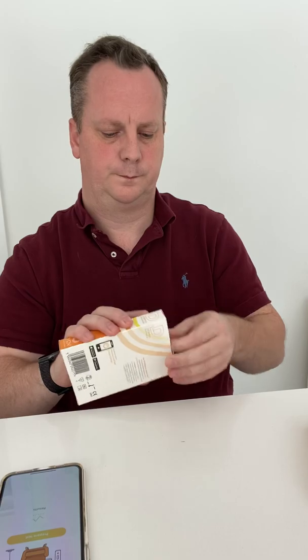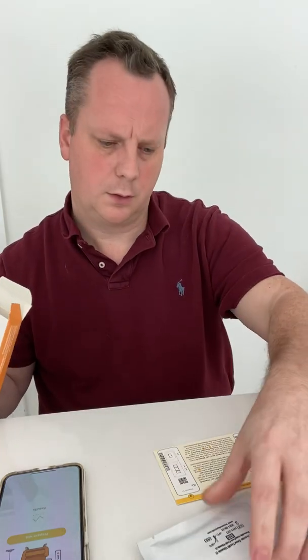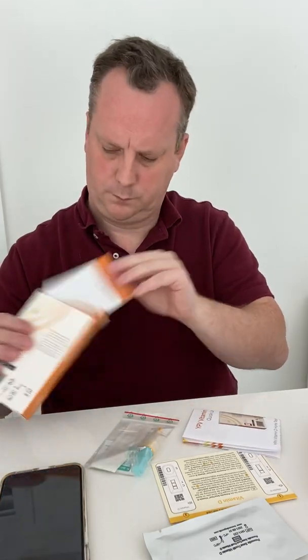You also need to download the Smart Test App. Now let's lay out the components. We've got a camera test card and a reagent cassette. There's also a quick user guide on how to do the test.